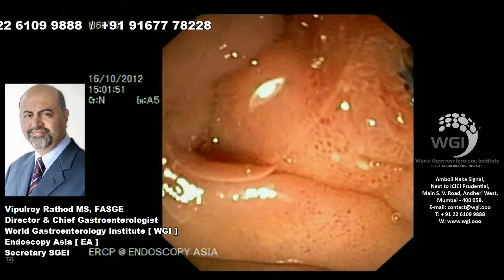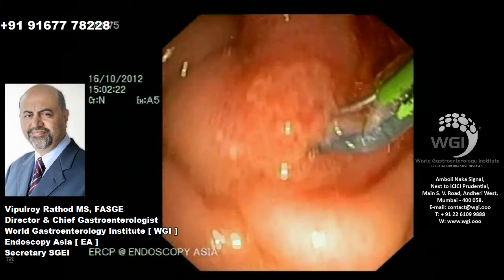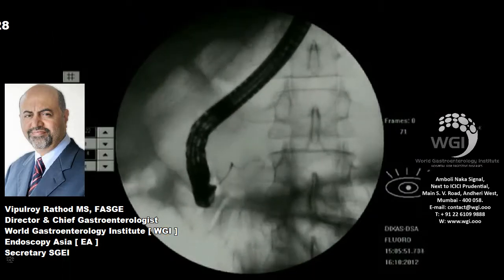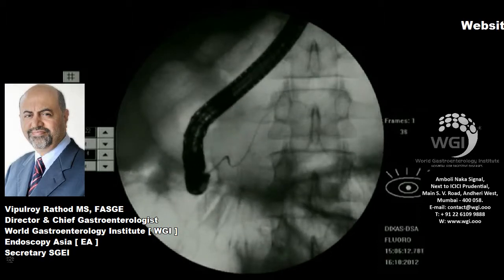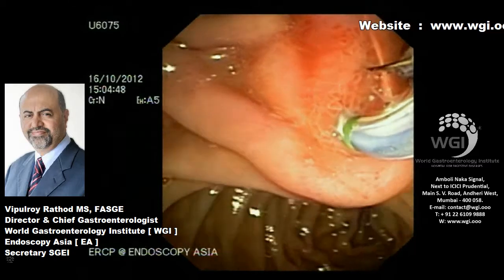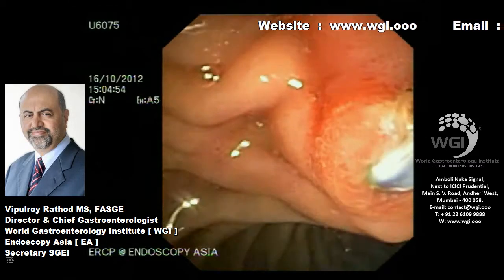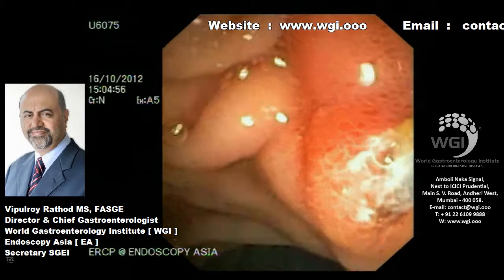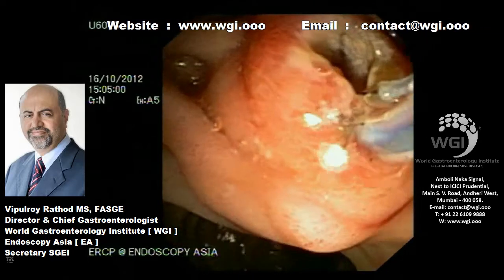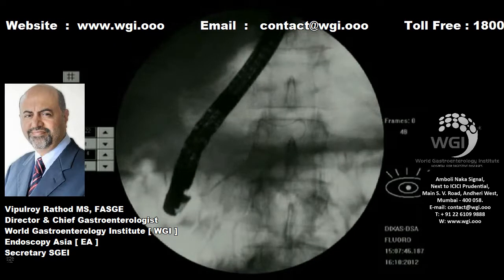So here, because of deformity, we are going straight ahead with a sphincterotome loaded with a guide wire, and you can see that we have entered the pancreatic duct, an almost S-shaped duct. So before we enter deeper, here we are making a change. Before pancreatogram, we are doing a pancreatic sphincterotomy. Because of deformity, we do not want to miss out and fall out of this cannulation.